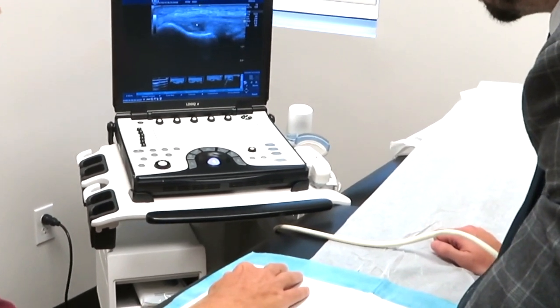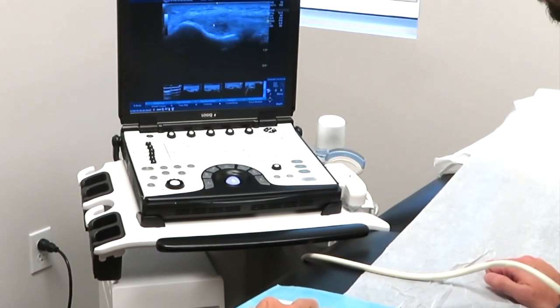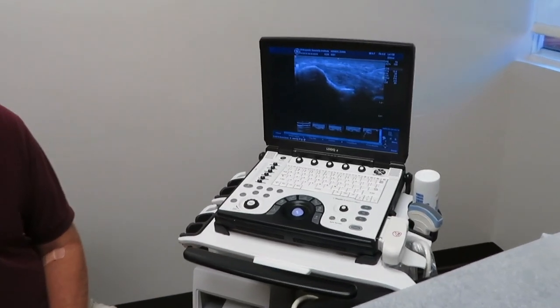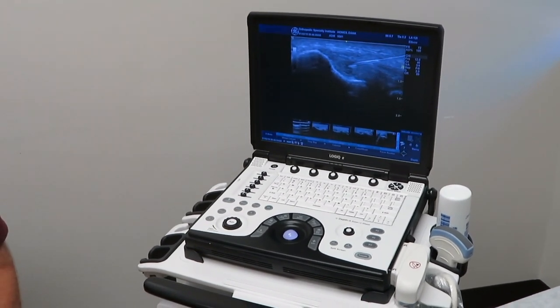So what we're going to proceed with doing next, we're going to bathe that tear in that tendon that is tendinopathic with leukocyte-rich PRP. Right in there — a little bit of pressure.